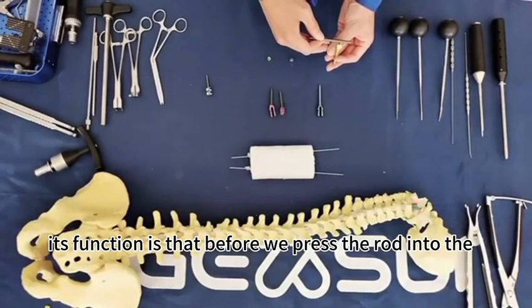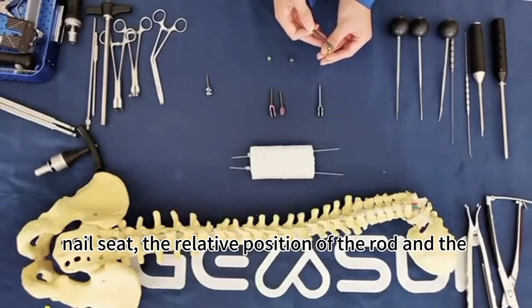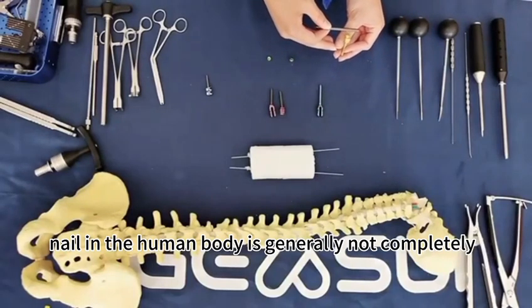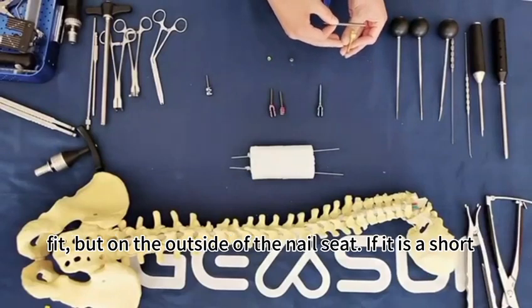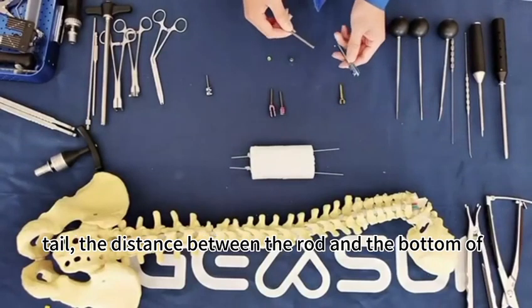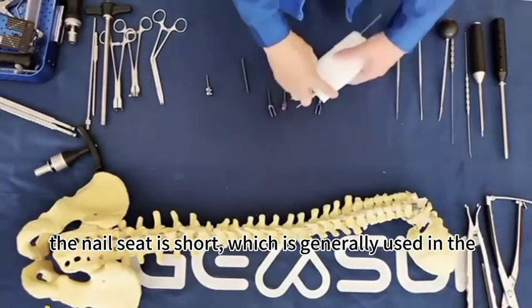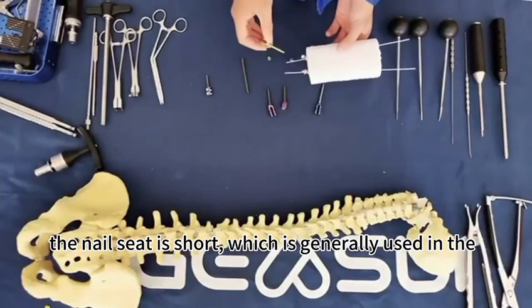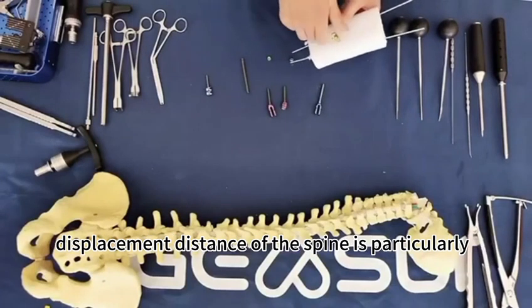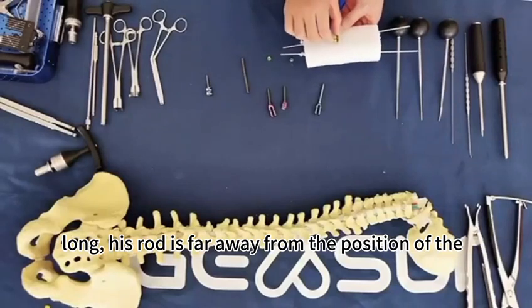its function is that before we press the rod into the nail seat, the relative position of the rod and the nail in the human body is generally not completely fit, but on the outside of the nail seat. If it is a short tail, the distance between the rod and the bottom of the nail seat is short, which is generally used in the case of relatively light spinal deformation, but if the displacement distance of the spine is particularly long, his rod is far away from the position of the nail.